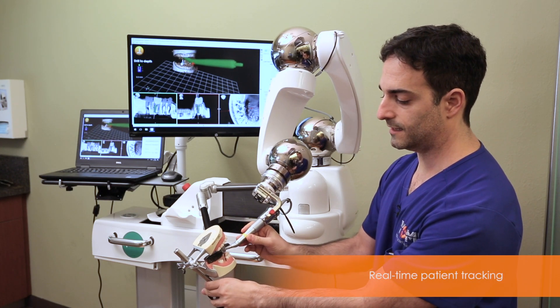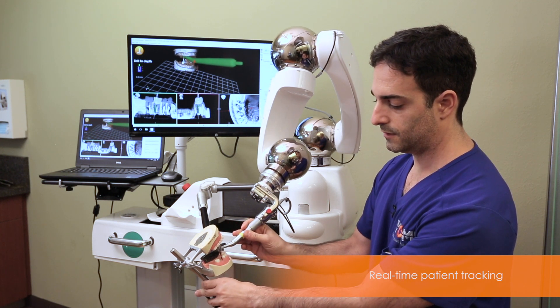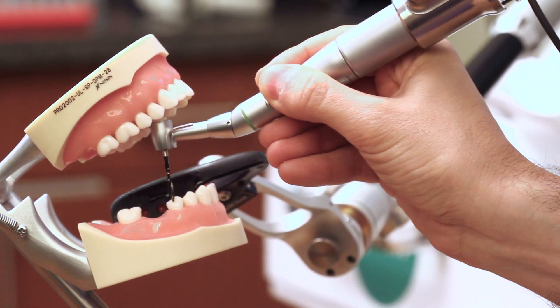If I move the patient, you can see the drill will always follow with the patient motion. When I complete the osteotomy, I keep pulling back and it lets me into free mode.